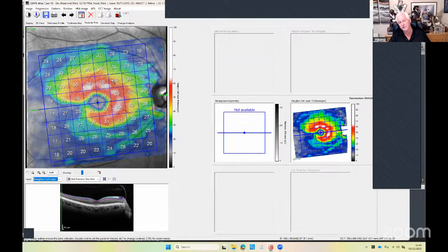And if the average thickness around here, typically in a normal eye, would be early 50s, let's say, we've even got snow-capped mountains here, 58, 59, but I've got an obvious imbalance here and notching and loss of ganglion cell. So, okay, it looks like a snail shell in the earlier stage of the disease process. And then I would follow my axons, and have I got a little notching of my nerve fiber? Have I got a defect down here? And have I got a depression inferiorly in the optic nerve? So this kind of completes the picture, except for one last step.